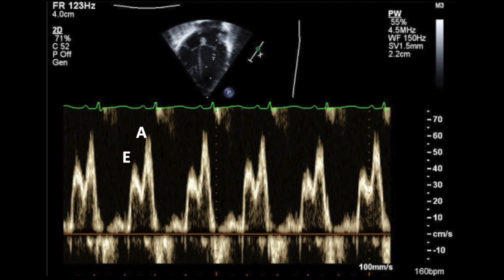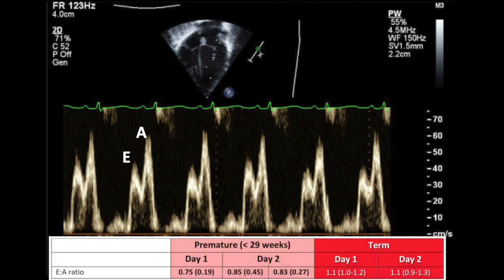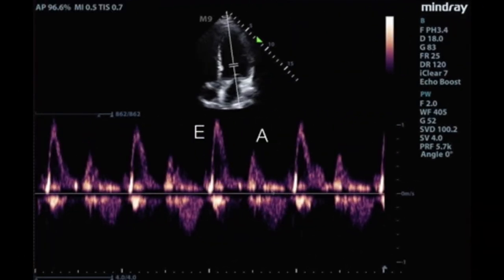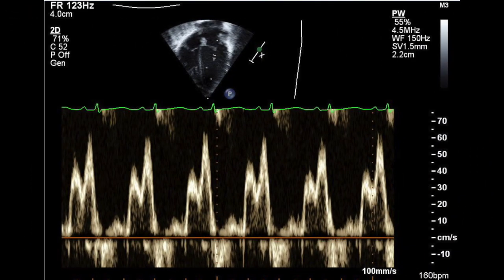I want you to pay attention to the ratio between the E and the A. As you can see, the E is smaller than the A, making the ratio less than one. The more preterm the baby is, the smaller the ratio is. This table shows some of the normal values we use for the E/A ratio — the ratio goes towards one when the baby is more like term corrected. This is as opposed to the adult E/A ratio, where the E is larger than the A, making the ratio more than one. So in neonatal units, specifically in preterm, the E is smaller than the A and the ratio is less than one.